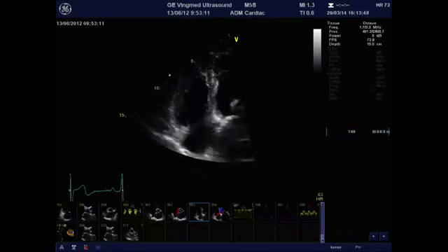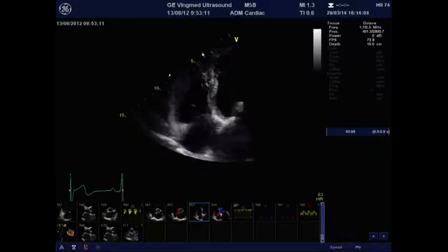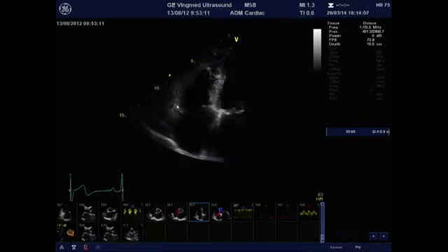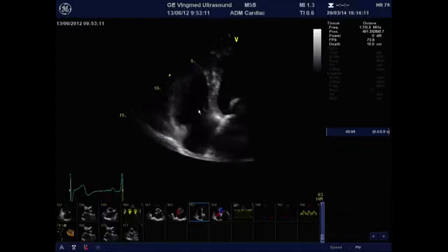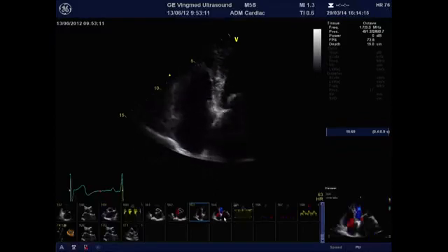And you can see here from this patient that there is a not so important dilation of the right ventricle, because the basal diameter is 3.7 centimeters, but what you can see, if I take my measurement off, is actually that this patient seems to have some kind of hypertrophy of the right ventricle. So this is an indirect finding that suggests that this patient has probably pulmonary hypertension.